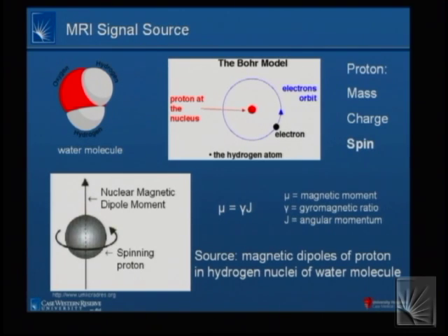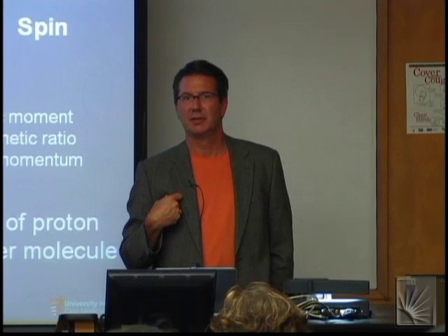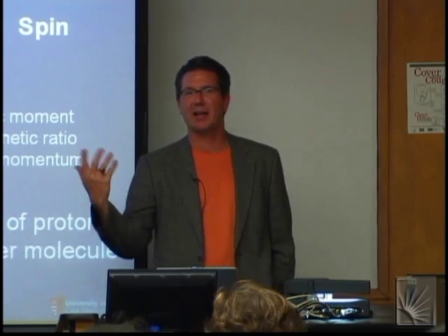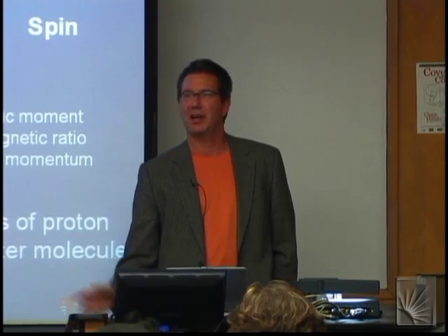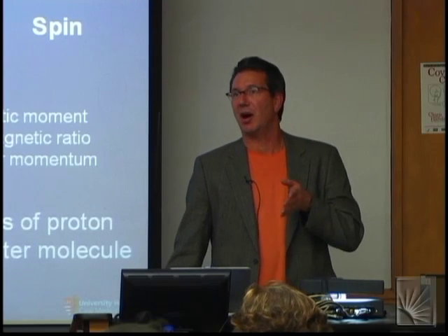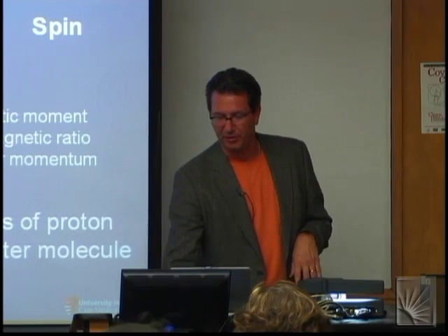Now there's other nuclei that have magnetic moments that we could be interested in. Carbon-13, phosphorus-31, O17, sodium-23, etc. Okay? But why are we going to pick water? Why are we going to pick protons? So now you guys can be biomedical engineers for a second. Why would I pick water? Why would I pick protons? Oh, come on. You have a lot of them. 80% of my body is water. Every water molecule has 2 protons. There's more protons in me than anything else. So if I'm going to attack anything with NMR, I'm going to go after water first. I'm going to go after protons first.